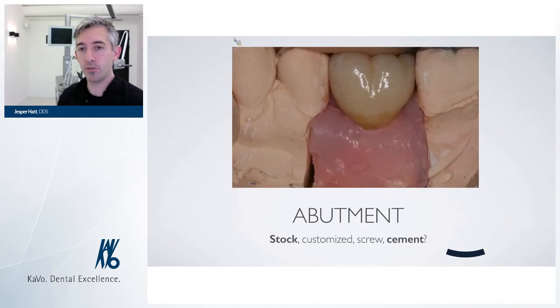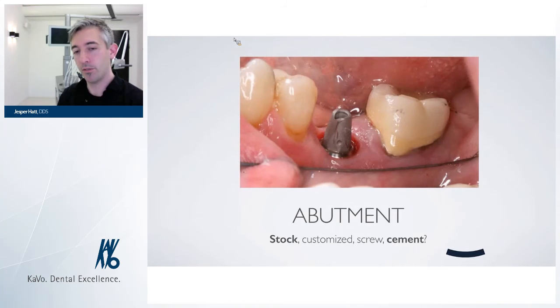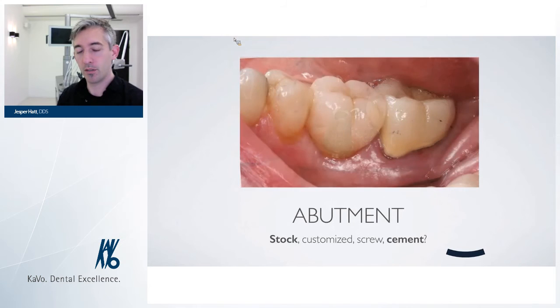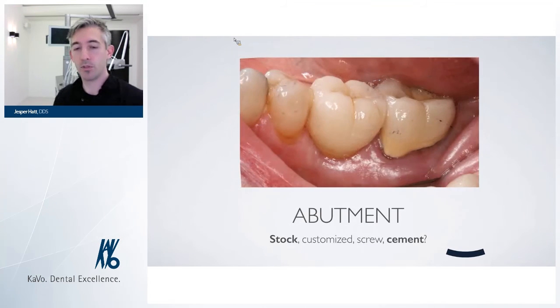The soft tissue is being pressed into position. Beautiful work by the technician. See it intraorally. We see the amount of soft tissue all around the standard implant. And here the crown is in place, and it looks beautiful, and it manages the soft tissue, as you can see before. It pushes the soft tissue into the correct position.